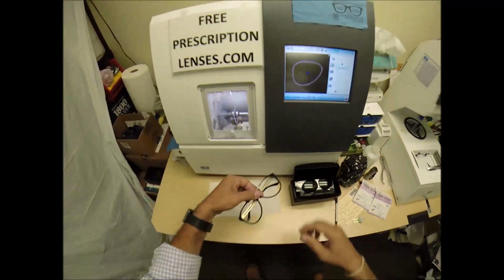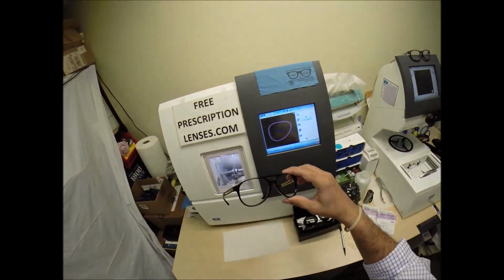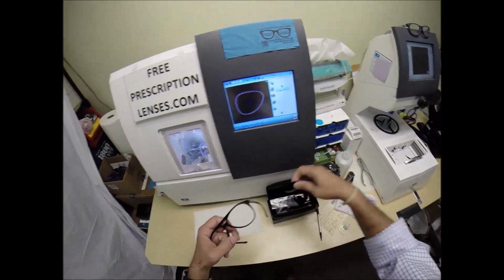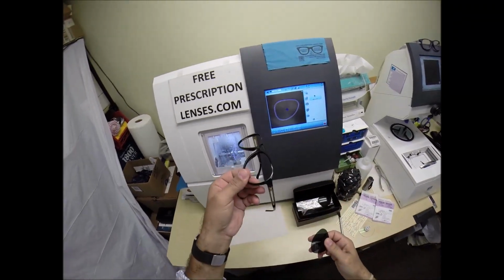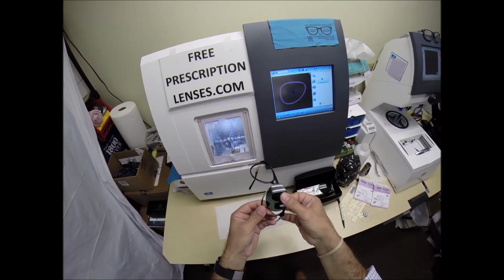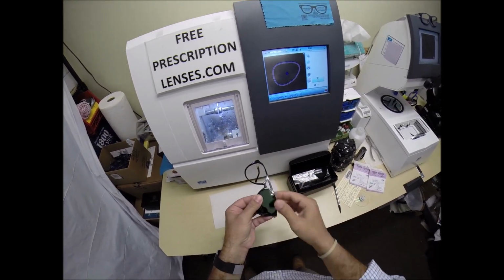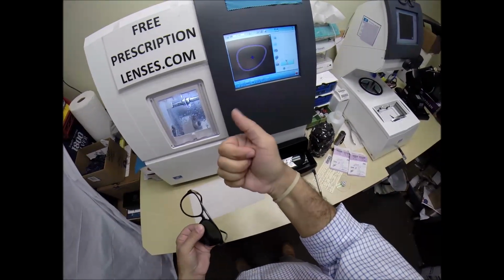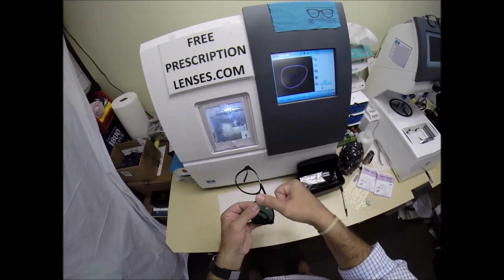So in order to change the lenses out, you have one pair of glasses that are going to be shades, the same pair of glasses is going to be clear lenses. So in order to put the lenses in, you have the frame, the side I'm working on closest to me, elbows touching my sides. Tuck the lens in at the outside corner, then you just have to thumb your nose at the idea. It's always with the thumb at the nose.